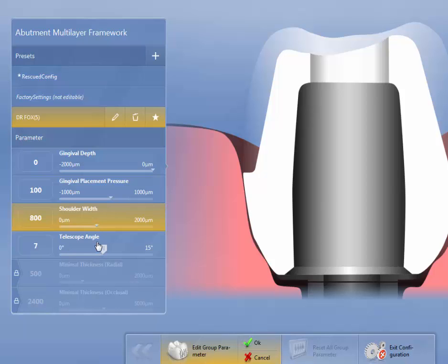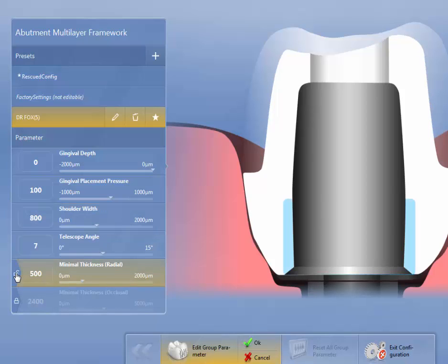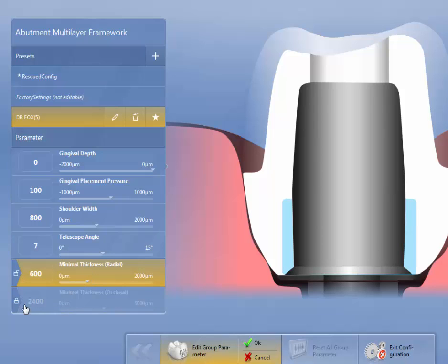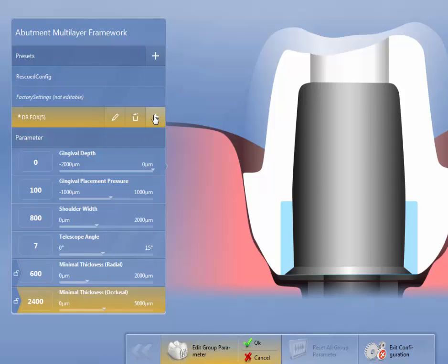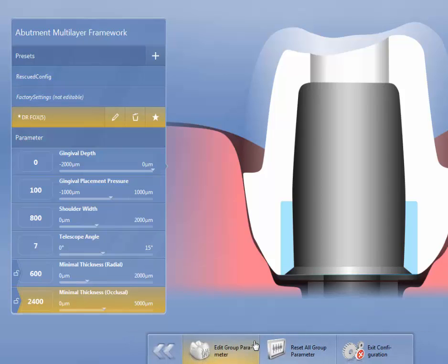Telescopic angle is 7 degrees. Minimal thickness radial, again, this is manufacturer's recommendation. And I go up to about 600 on that. And then minimal thickness occlusal, they want 2400. Again, this is just the minimum amount that we'll show. So I'm going to click that as default, and then I'm going to also hit OK. We'll go backwards.